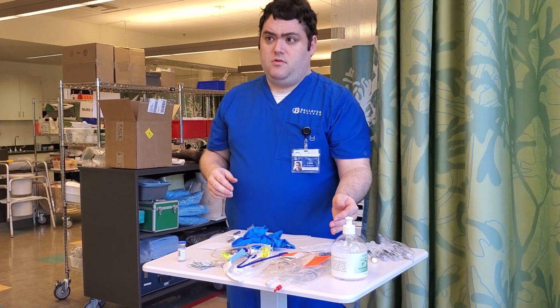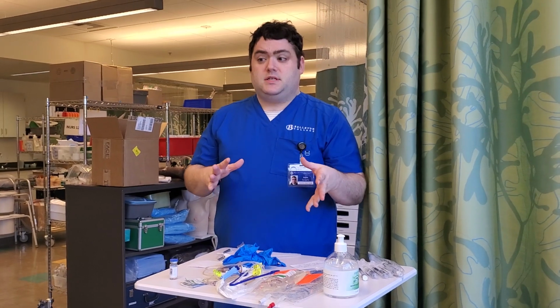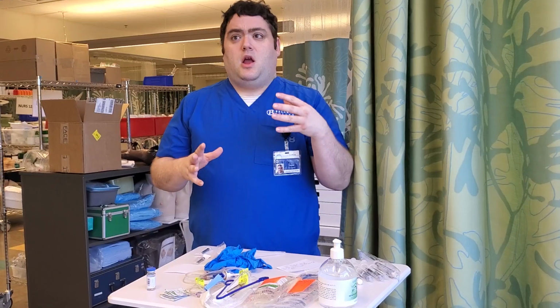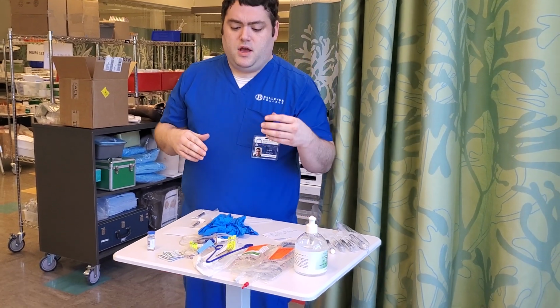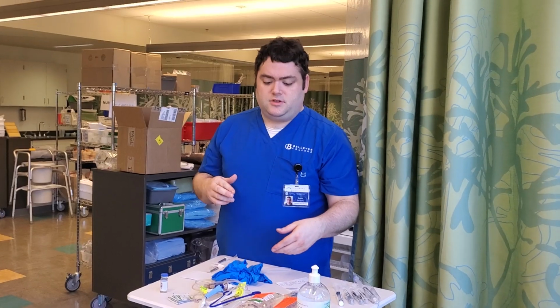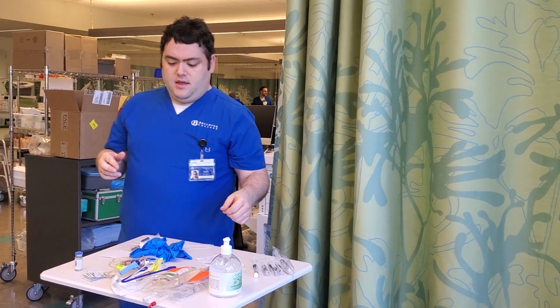This is going to be used for hydration. We want to assess the site before we administer it, and notice that it can cause fluid overload and adverse effects, again fluid overload and electrolyte imbalance. The safe dosage for this is 75 to 125, and we're going to be giving her 125.